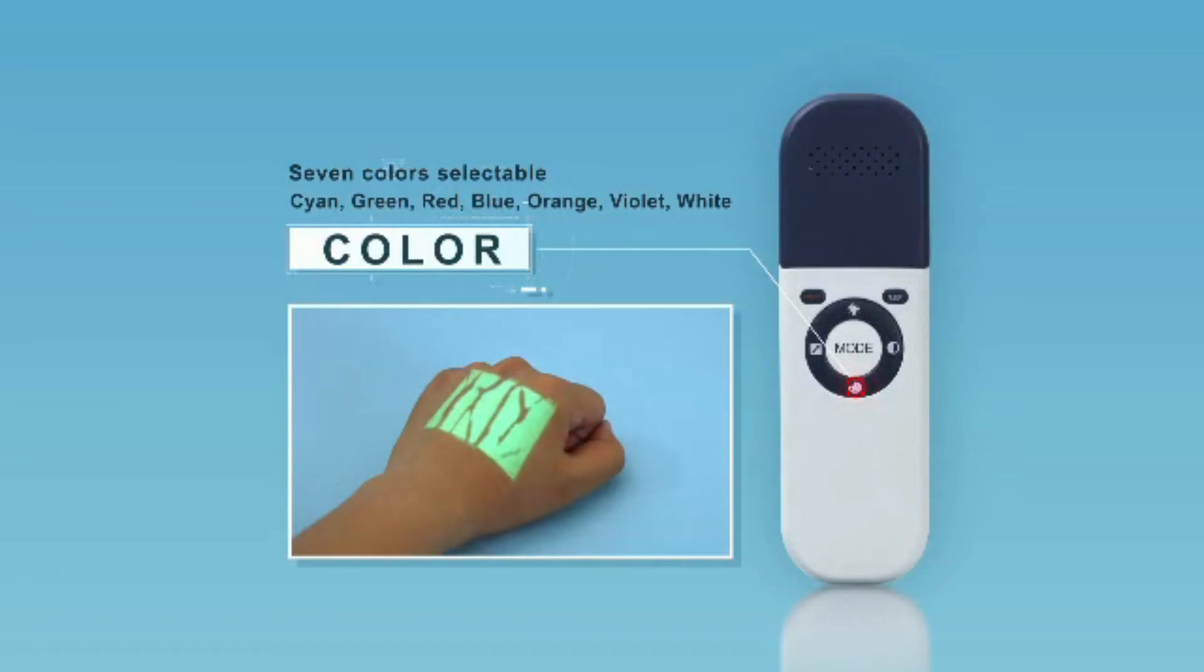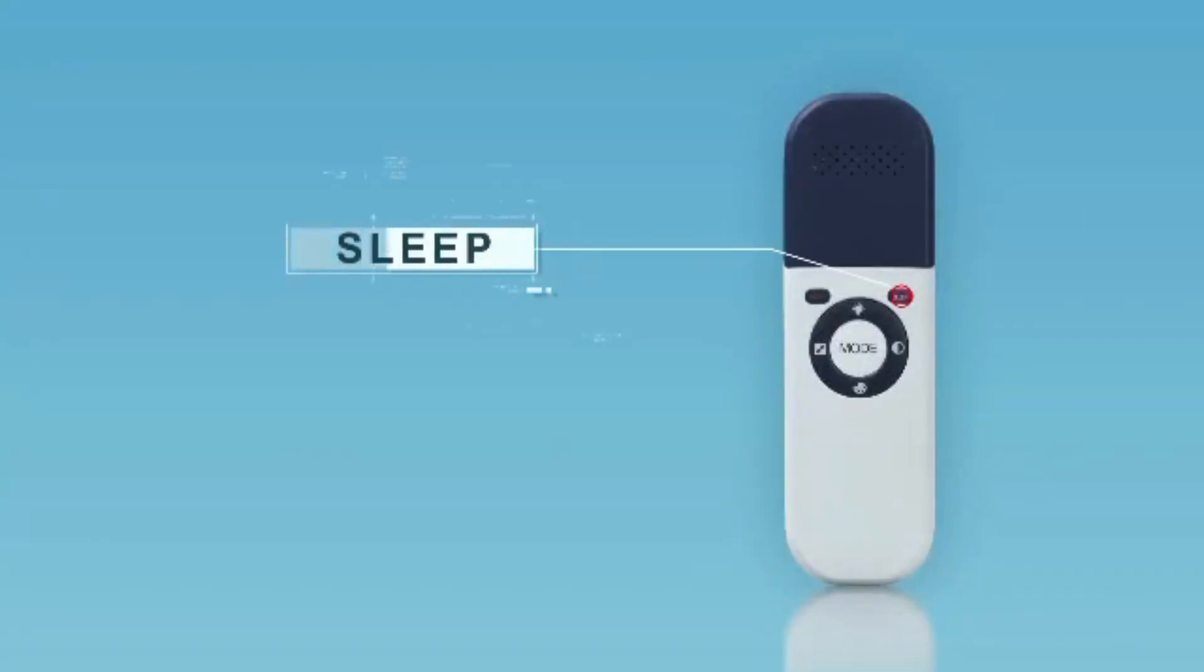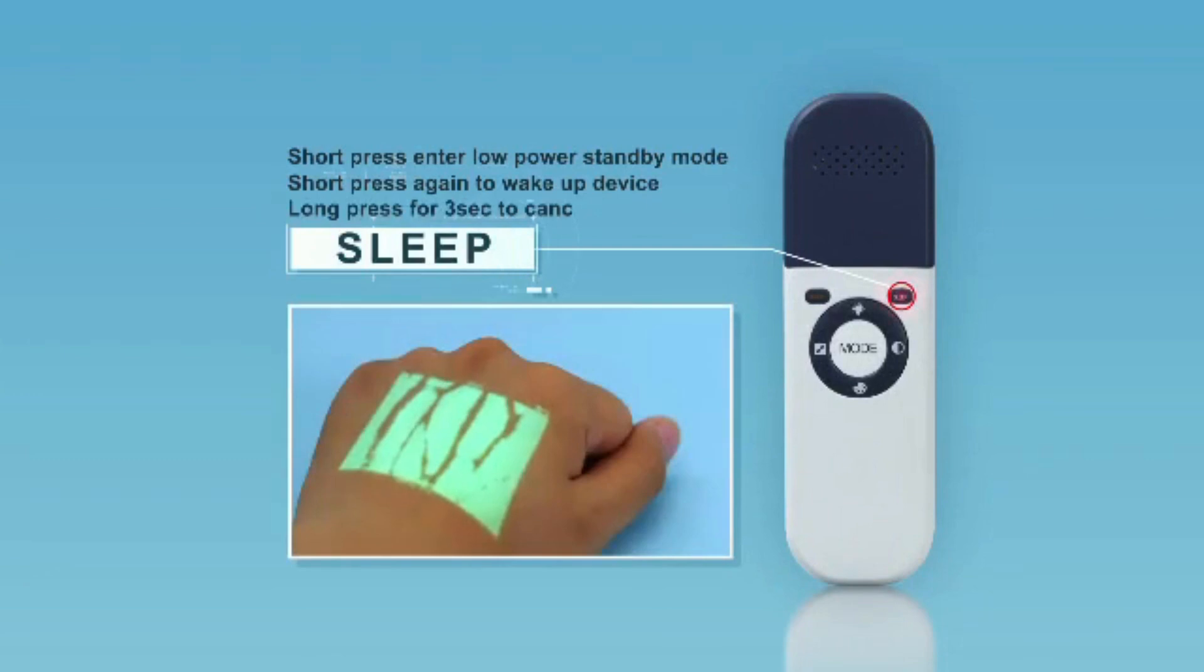Short press sleep button to enter low power standby mode. Short press again to wake up the device. The default setting is for the device to enter standby mode automatically if no operation for 10 minutes. Long press sleep button for 3 seconds to cancel timer function, which is shown by the timer character in top left of projected image disappearing.